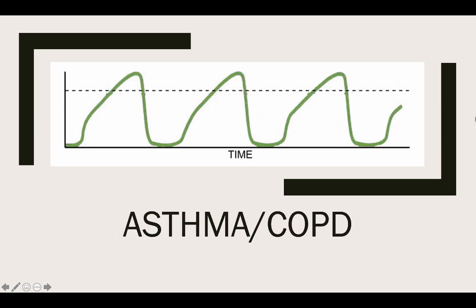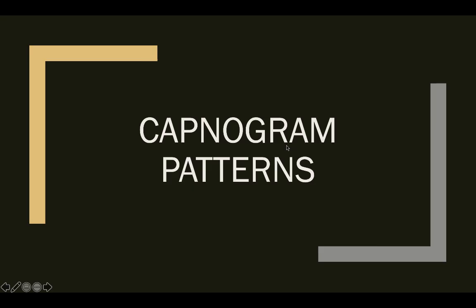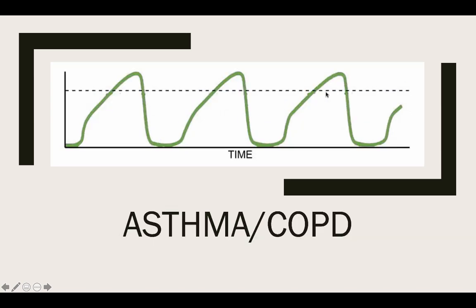Now some fun ones. So we went through hyperventilation, hypoventilation. They look normal, right? That's our normal. Well, let's go into some fun ones like asthma and COPD. And all of a sudden we don't have a nice square, or even a little upslope square like we should. We've got what we're going to call a shark fin. Womp, womp, womp. Right? So it's Shark Week here at EMC.